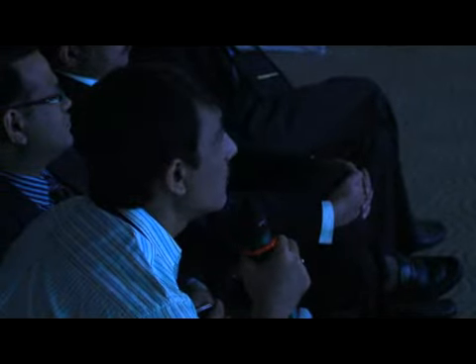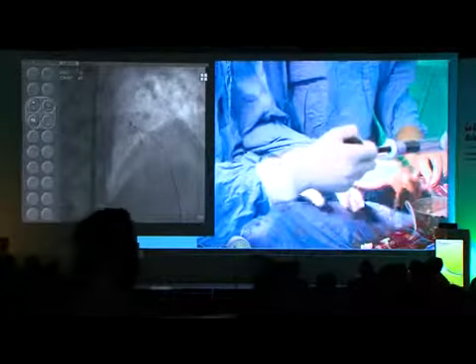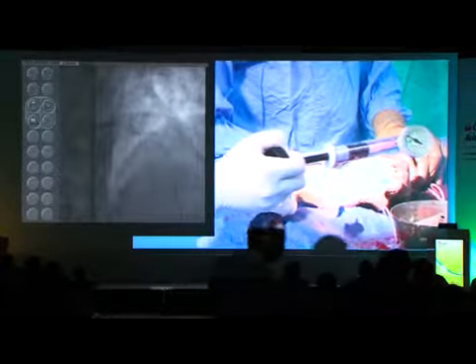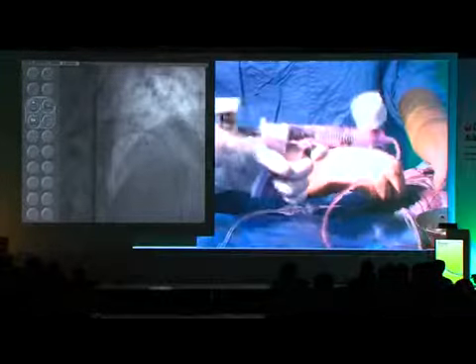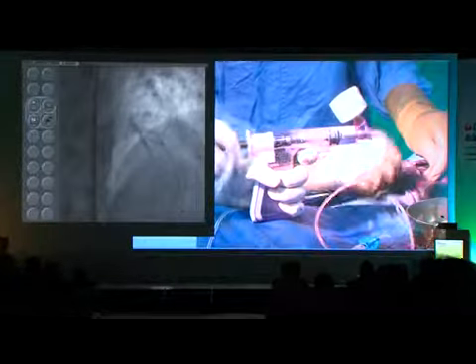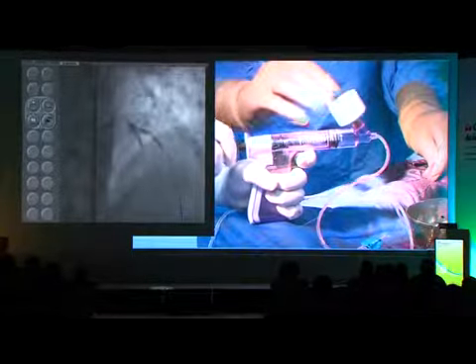I'm going up. No, enough. Then you might miss the ostium as such. The basic concept will be lost again. Come down. Come down. Because it seems you have not covered that side branch ostium. You have still left a part of it. This is the stent side branch. Whatever I'm seeing, I think I'm quite happy. Okay, go up together. Go to 6. Just the diagonal a little bit more, 8, 7, and go 8. Go down. I'm on the diagonal. Go down. 8, 9. Okay, enough.